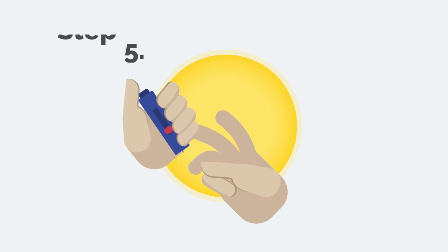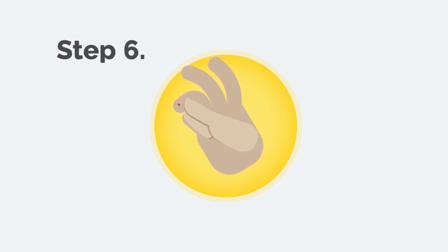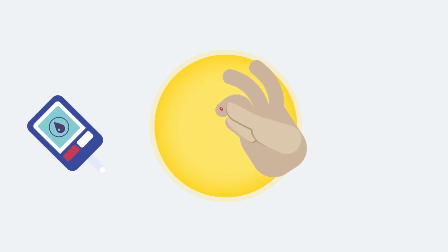You'll feel a slight pinch. It's not painful, but may feel a bit surprising at first. Pause for a moment and gently squeeze the finger you just pinched to help a bit of blood bubble up. Your meter won't need a large drop.